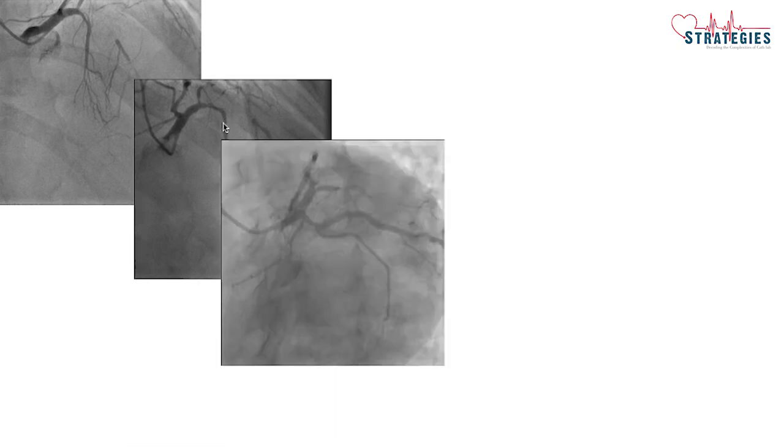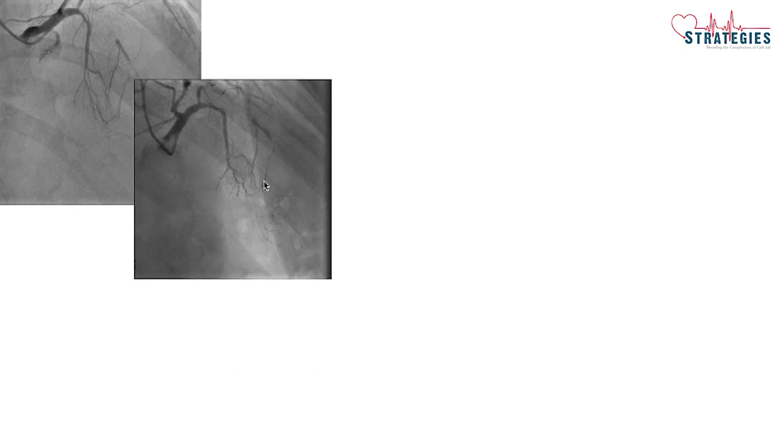Then if you see the angulation within the CTO segment, there might be no angulation within the CTO segment. It must be a relatively straight segment. And when you look at calcium, fluoroscopically there is no calcium. And for collaterals, there is a good septal collateral, which is filling the distal vessel. It's very good, almost we can say CC2 collateral. And the distal vessel is quite good and big sized, nearly around 3 millimeters in size.